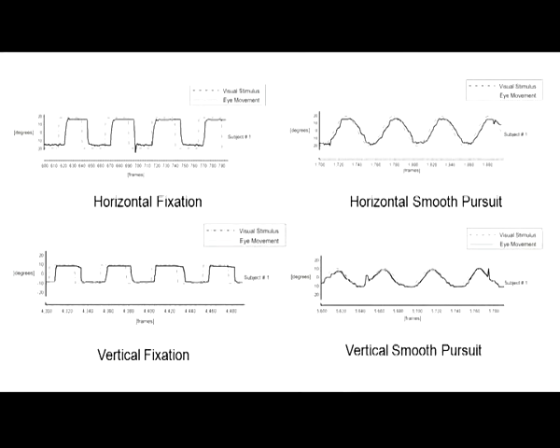And these are some results. In this research we can prove that the user can use these tools to detect the voluntary eye movements. And for the next experiment, we also measure the involuntary eye movements.